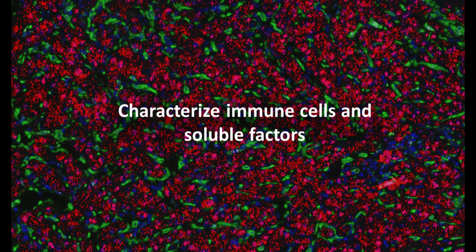One of the most important workflows of using RNAscope is its ability to combine RNAscope with immunohistochemistry or immunofluorescence. Because of the natural complementarity of these two technologies, we can use that in combination and visualize RNA and protein simultaneously on the same section.